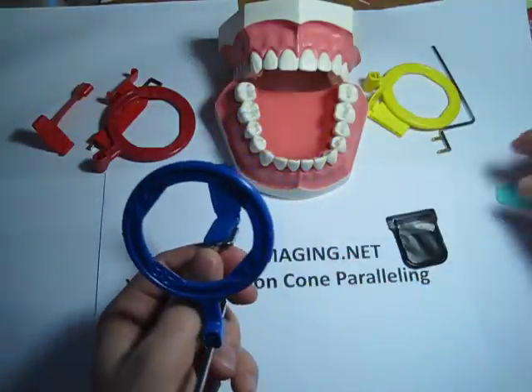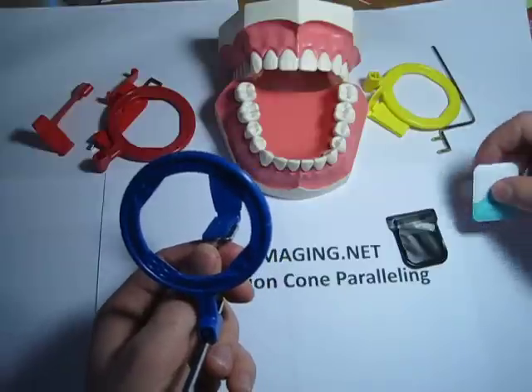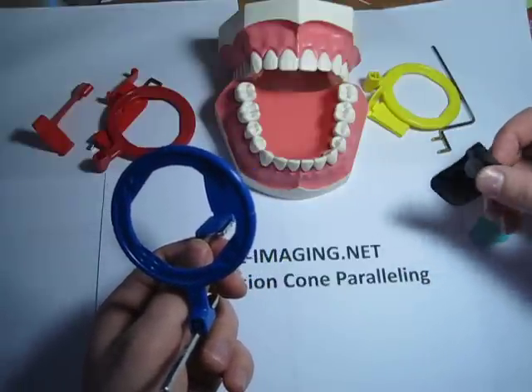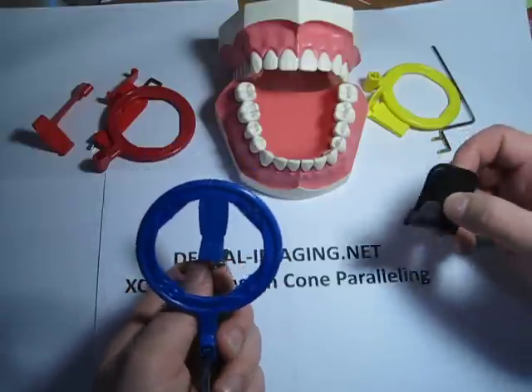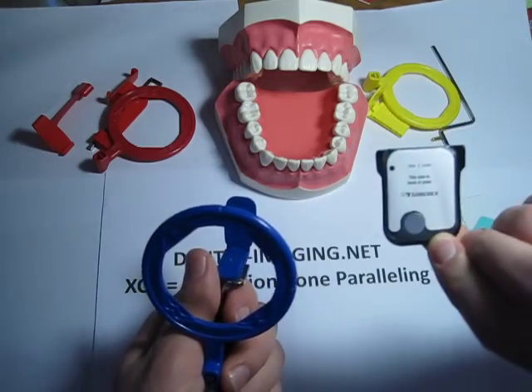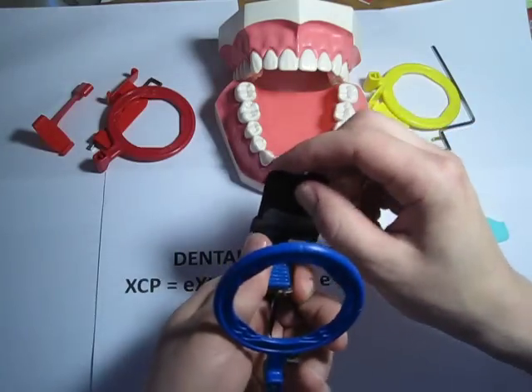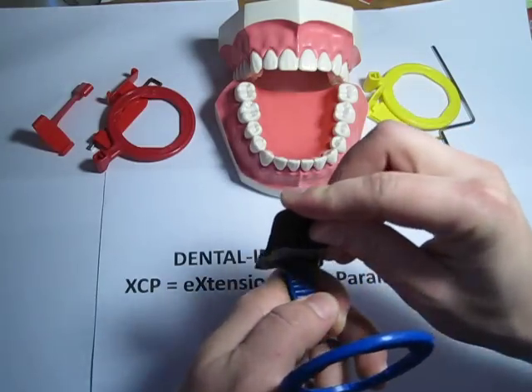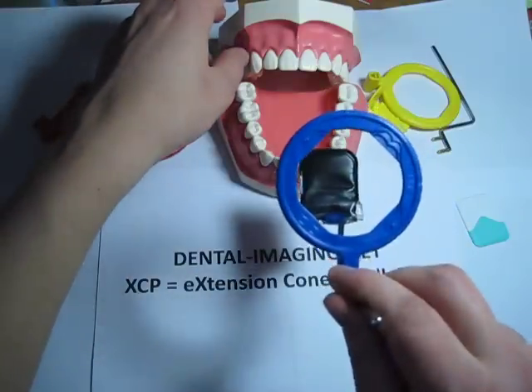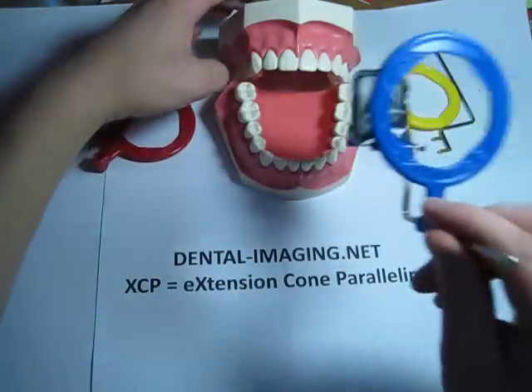We have a couple different sensors being used nowadays. What I'm going to put in now is a PSP plate — it's wrapped — a photo-stimulable phosphor plate. Put it in like this, and then you look through the ring and you can see the plate there.